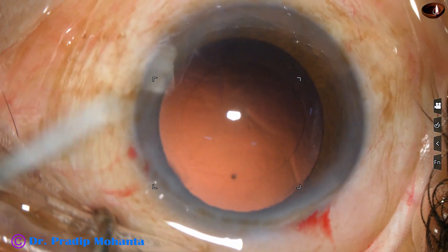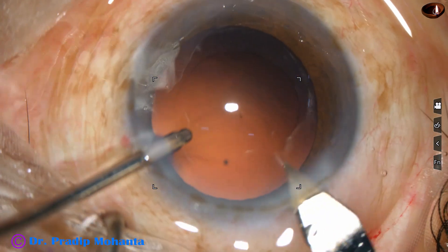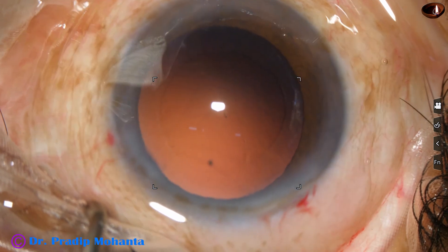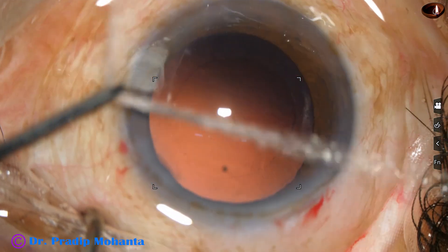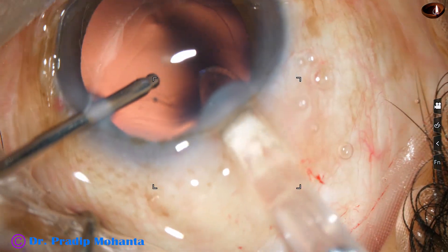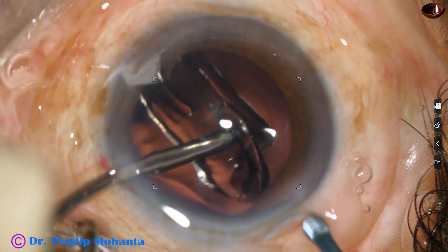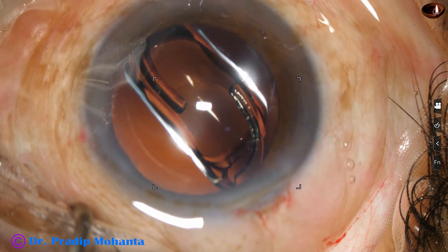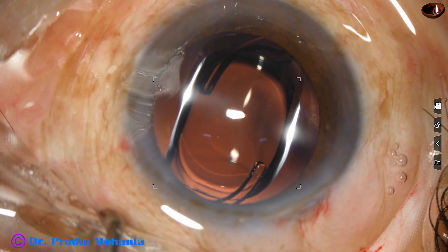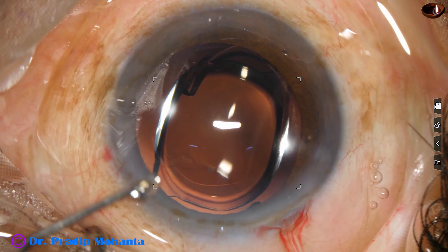Now, implantation of an intraocular lens. This is a hydrophobic acrylic intraocular lens going through a B cartridge. I enlarge the main wound to about 3 millimeter and implant the lens. The main wound is about 3 millimeter, the side port is about 1.6 millimeter, and the side port is placed 90 degrees away. Astigmatism induced by the main wound is neutralized to some extent by the side port because it is placed 90 degrees away.